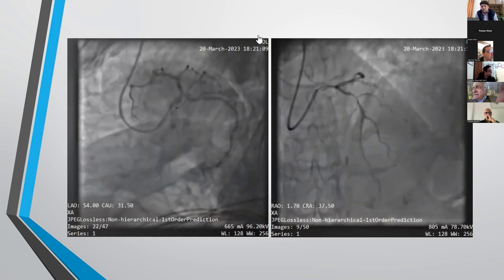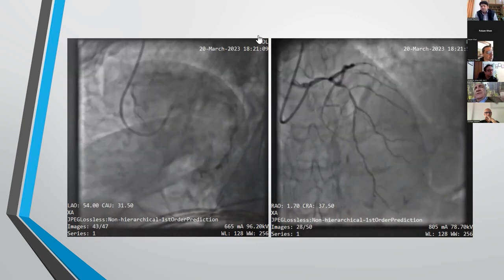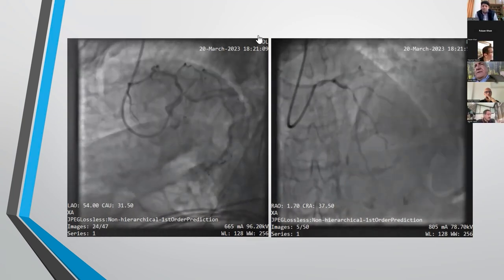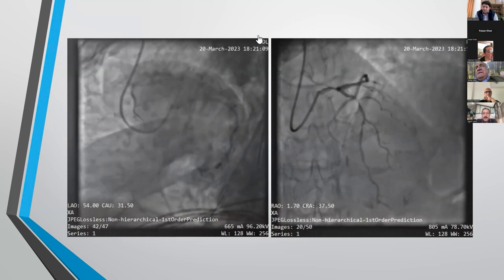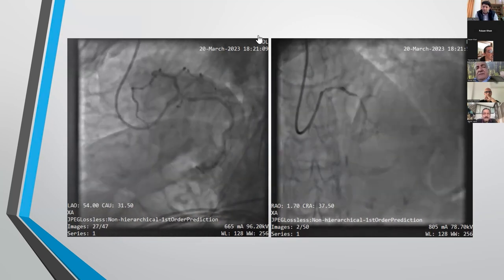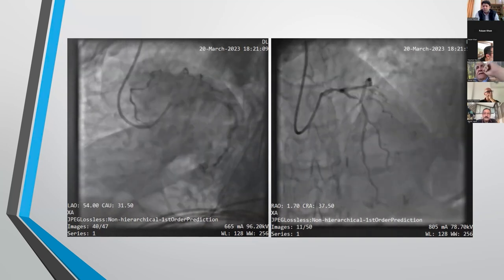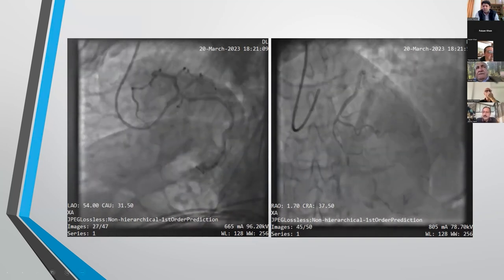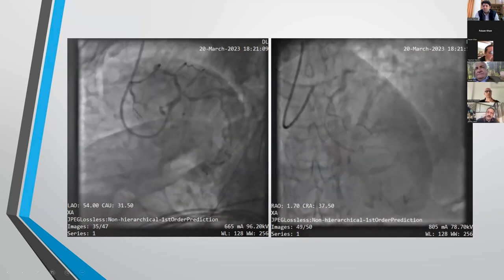I think Bashir is coming up with a concept of reuse and resterilization of this equipment, and if we can see what the guidelines are, there may be a possibility. I mean, we can use the same IVUS in the same patient in other vessels also. So it's a taboo question. Can I ask, do any of your centers reuse it? Yeah, okay, let me tell you.